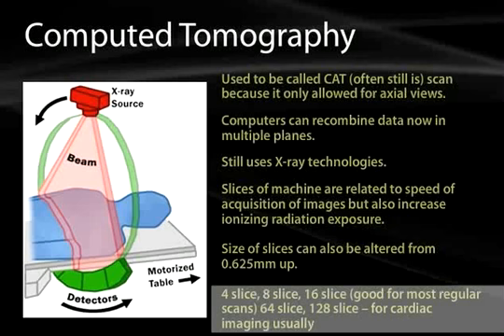So when you're working in a complex 3-dimensional world where you're having a moving heart that moves not only in one direction but all 3 directions, and you're trying to image the lumen of a very small vessel and see whether it's 60% or 90% occluded, you have to have high definition images that are grabbed in real time, and temporal distractions of the capture of that can be problematic for interpretation. So they typically use the larger slice machines for fast acquisition of images, such as in thoracic imaging. 16 slice is common in regular hospital now.